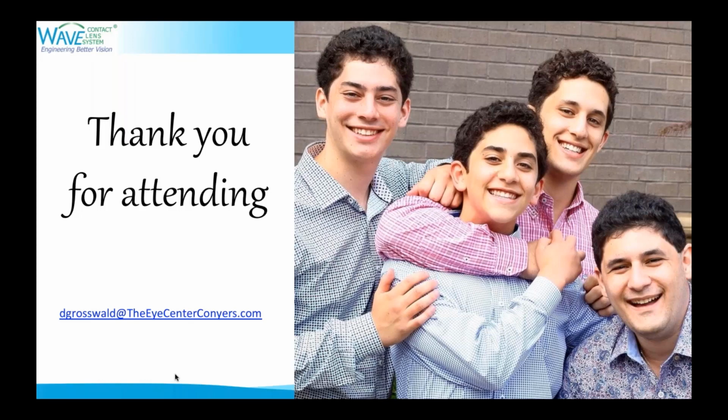I guess we're a little bit over time, so we have time for maybe 1 or 2 more questions. So, do you ever use a trial lens set still? Yes, I do. Ken Maller has done some great discussions for Oculus, and in one of the lectures he did in January, he said these lenses you nail it almost the first time, so I might start fitting the lens by putting the diagnostic lens on first, because he was nailing the fit but not getting the power right. Again, we're too busy. I don't want to see my patients anymore, and they're busy. They don't want to come in.